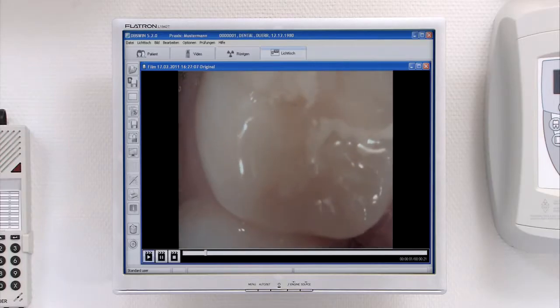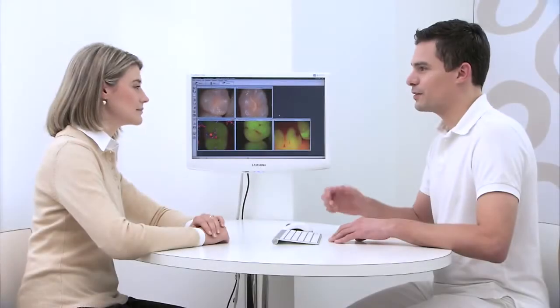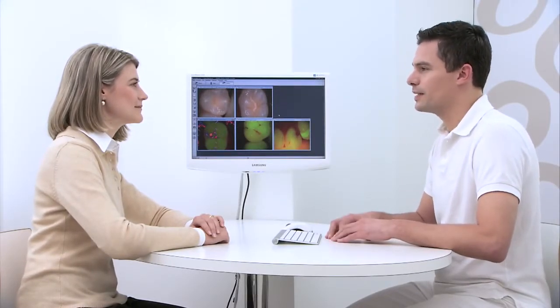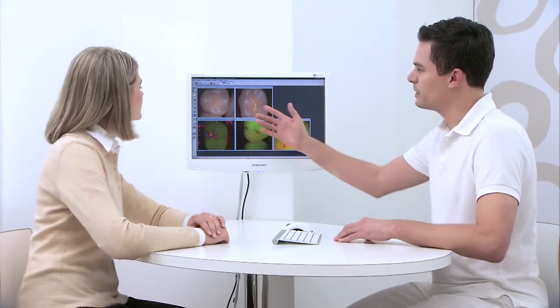Video clips can be easily recorded in order to, for example, document the current state of a patient's tooth. The image data can be used at any time — during a discussion with the patient, as the basis for commencing treatment, or for showing the stages of the treatment to be carried out.